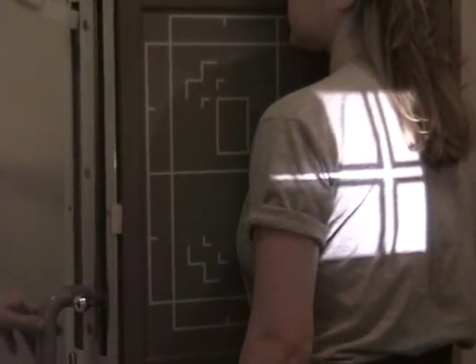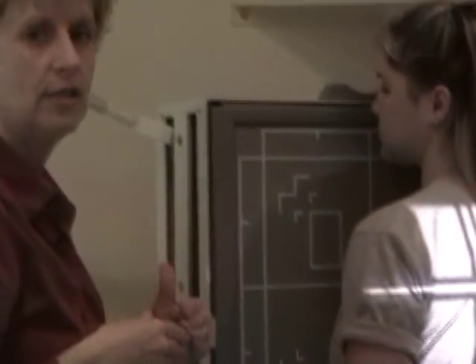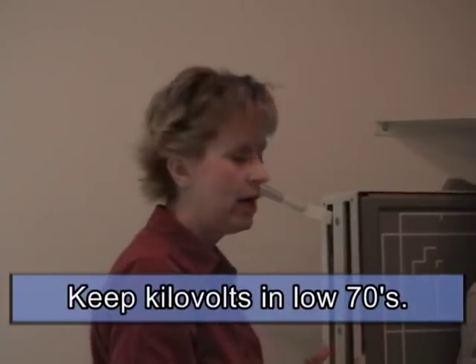Collimation is very important with the sternum because the sternum is hard to see. Contrast is very low. You need to do anything that you can to make that sternum stand out, to be more obvious. Tight collimation will reduce the amount of scatter, which will in turn increase the amount of contrast. Also, keep your kilovolts down into the low 70 range. That will help the sternum to stand out with more contrast.